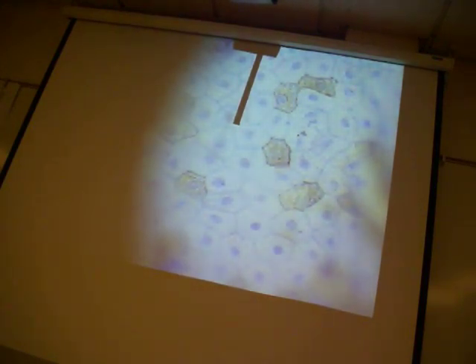So if you look on a frog, down where the rump is, by the hind legs, one of the things you'll find down there is a specialized area called the seat patch. They always try to keep their seat patch in some water, and part of the reason is so they can gas exchange right across there. One of the reasons they want to keep their skin moist is so they can allow for that gas exchange. Once the skin starts to get dried out, that gas exchange becomes pretty much non-existent. It's not as efficient for these guys. And so they have this nice thin tissue right there.